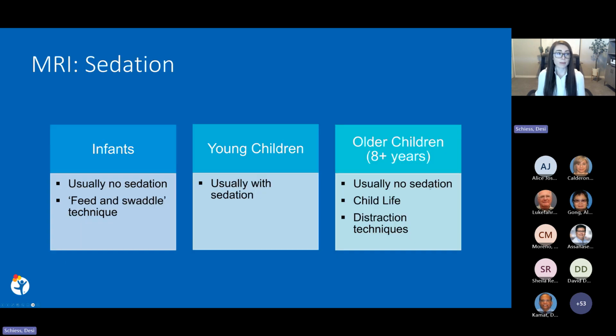The benefits of MRI must be weighed against the risks of sedation, which may be necessary in certain patient populations. Infants can often be imaged without sedation using a feed and swaddle technique. Older children are often successful without sedation with the help of child life specialists or distraction techniques like music, movies, or even virtual reality goggles during the exam.